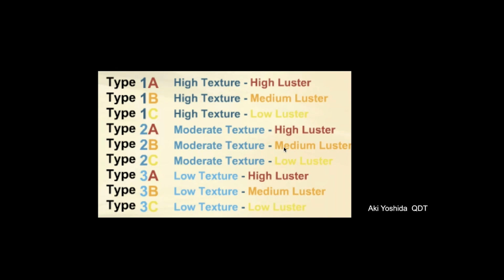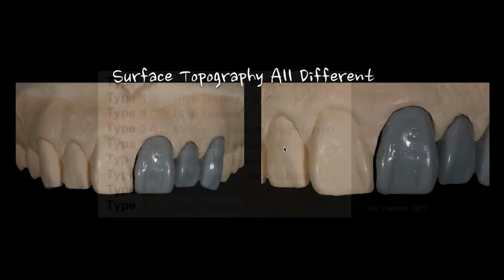So it's nice to classify these. Years ago, I was trying to put more of this into my scripts and have the doctors pick, and it never really worked out as well. So I think I got away from it over the years, but I still use it when I'm thinking through the tooth, especially when I'm trying to match the teeth that I'm working through.